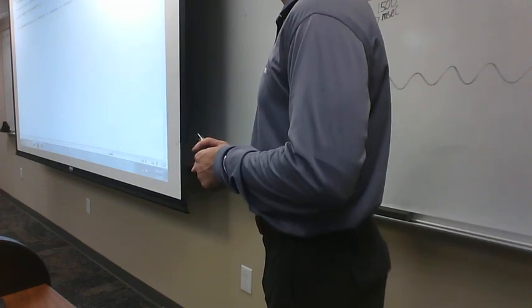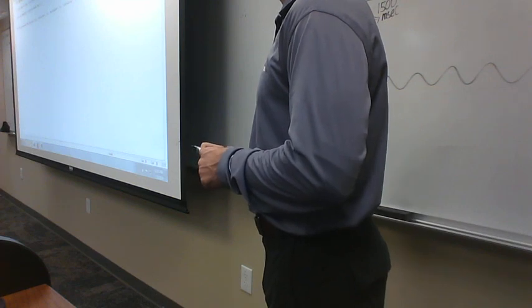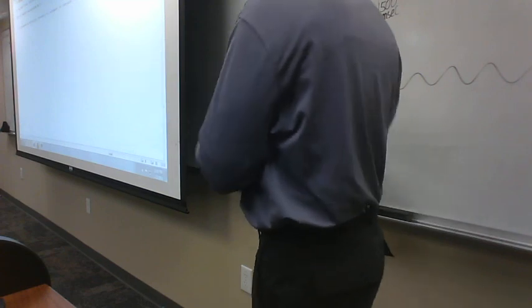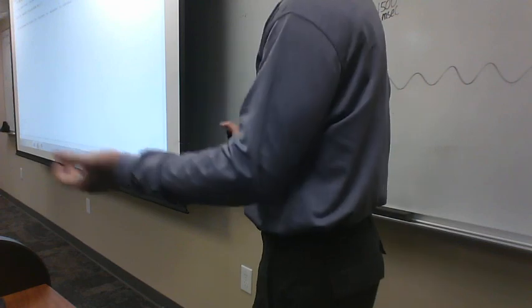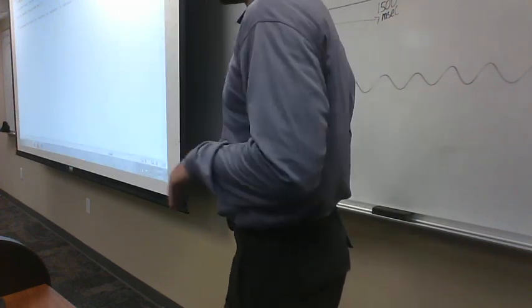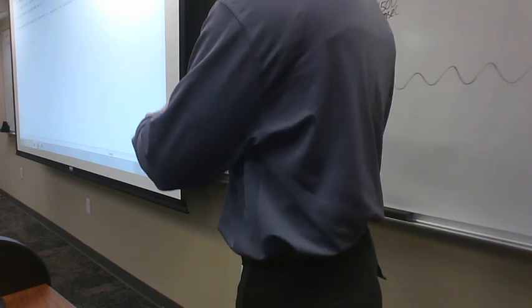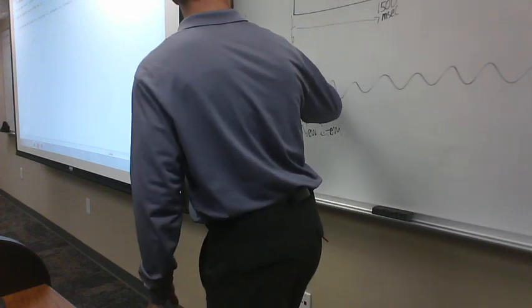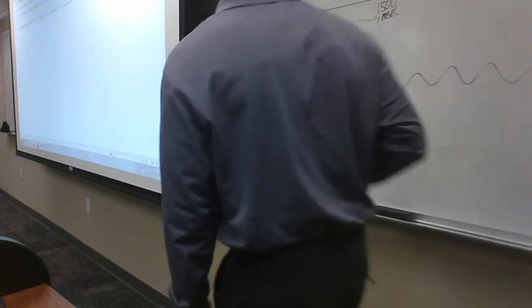Yes, ma'am? Are the numbers specific for like this experiment, or is that all of these? It's just for the experiments we'll work with in this class. Because I invented this. I mean, when you design a study, you just have to decide what numbers you want to represent what. So you just cook it up here. So you can make it different for any other studies. This is just for this class. Okay? So you're going to have an event code here that's 61. Okay? And it's integrated into the EEG.